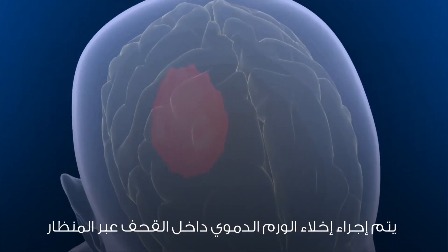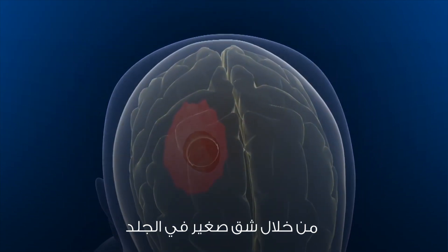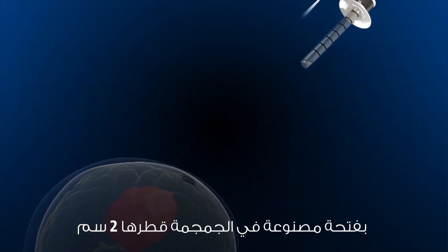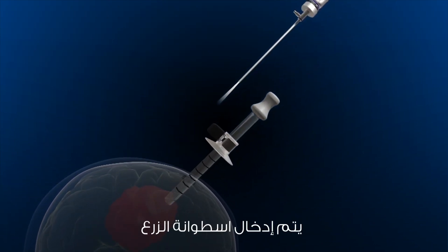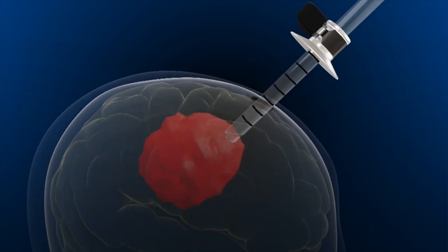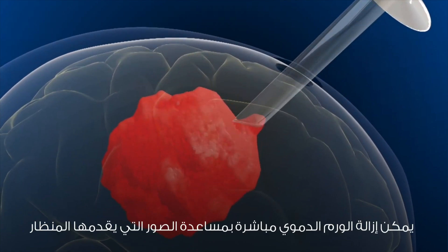The endoscopic evacuation of intracerebral hematoma is performed through a small skin incision. A keyhole two centimeters in diameter is made in the skull. A transparent cylinder is inserted with a 4-millimeter endoscope toward the hematoma cavity.